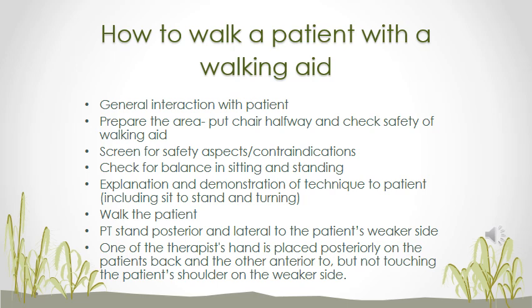Check safety of the walking aid as well. Make sure that it is steady, that the rubber tip on the end is still fine, and that it is safe. Screen the patient for the necessary safety aspects and contraindications of their condition before you start. For instance, don't let them walk with socks on because they will slip.